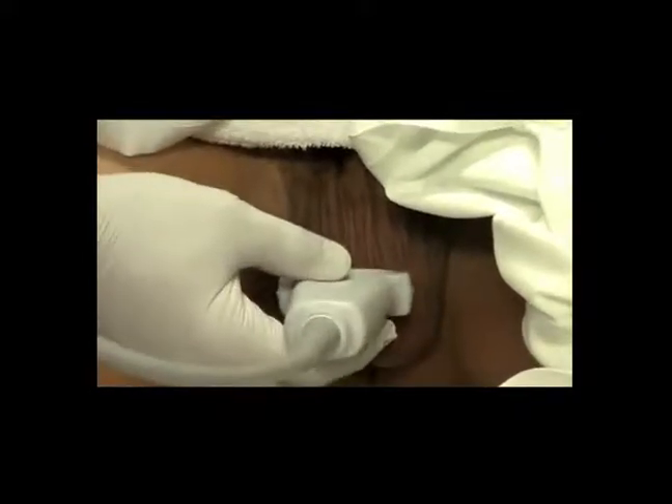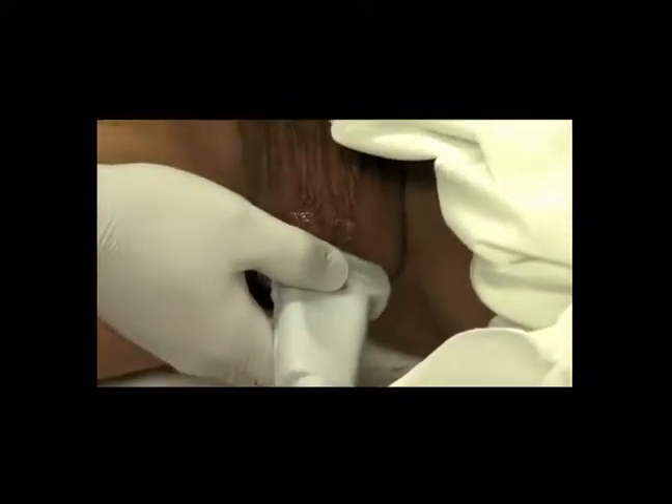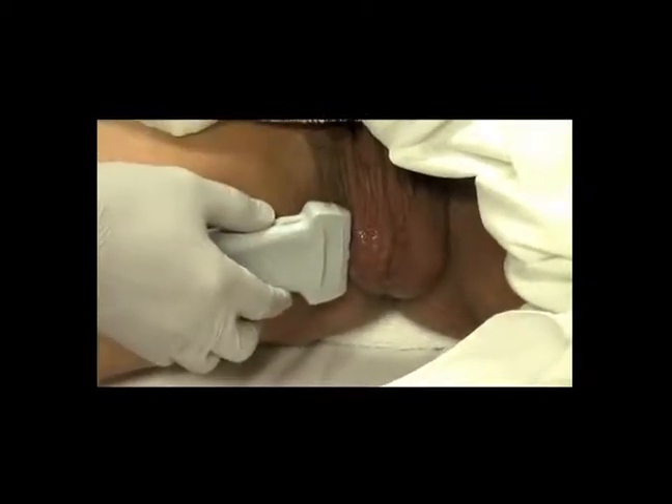Next, you want to go in the short axis with the indicator towards the patient's right-hand side, scanning through the entire testicle in its short axis. A special view is called the cleavage view, which puts both testicles together and you can compare them for different echogenicity, size, and shape. You'll notice the probe is angled a little bit more inferiorly as the left testicle hangs down a little lower. You'll then want to get a nice coronal view of the testicle with the indicator up towards the patient's head to view the epididymis as a whole.